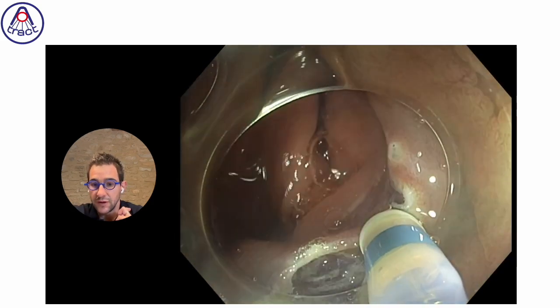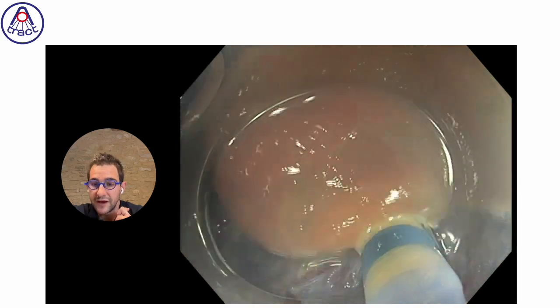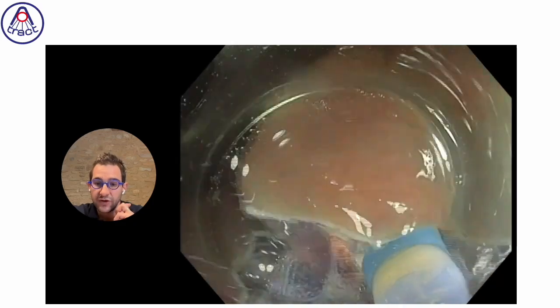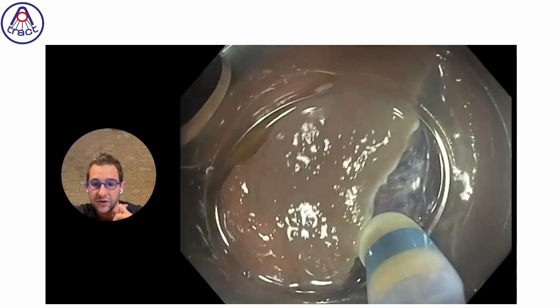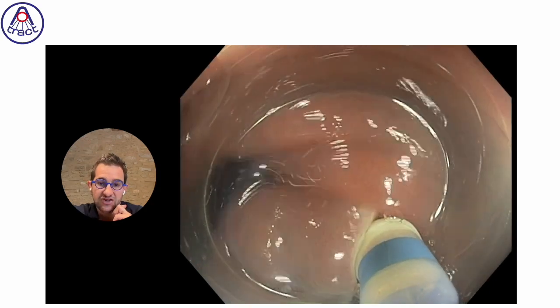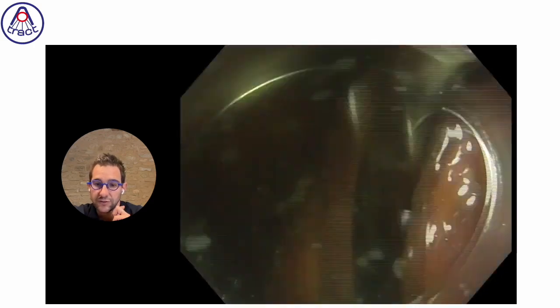And sometimes in very difficult situation, you want to place the traction very early in order to change the shape of the lesion, but sometimes you do it too early, and therefore you will lose time, in fact, because it's more difficult to catch the edge properly without catching something you don't want to tract with the lesion.